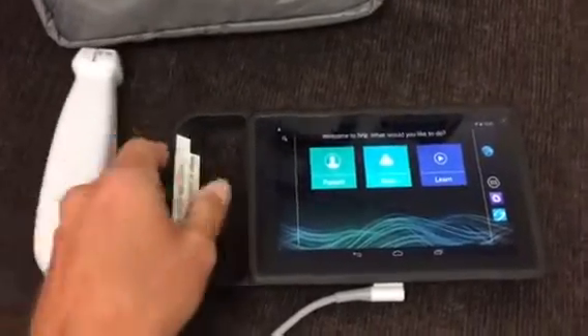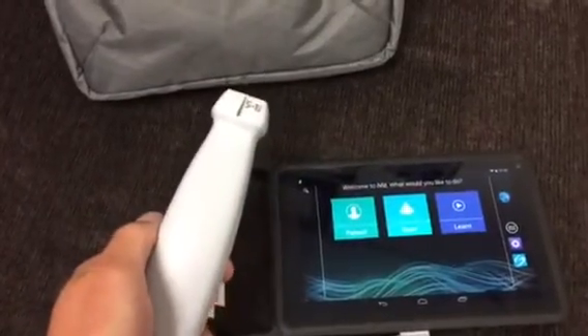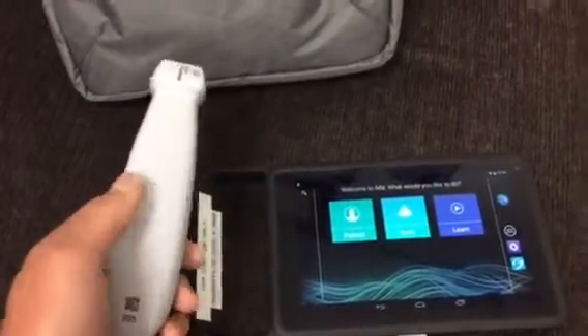As you can see, it's a tablet setup. We have a phased array probe, so this is useful for heart, lung, and abdomen imaging — not useful for lines.